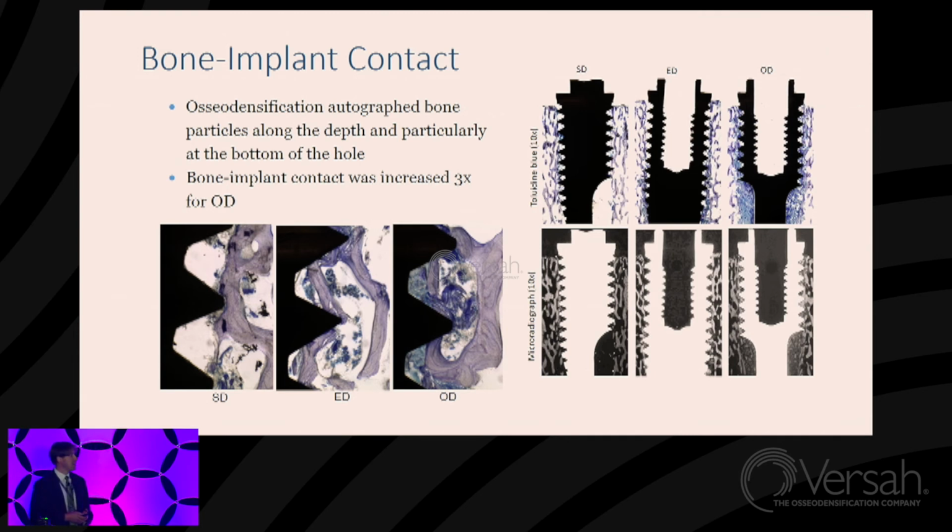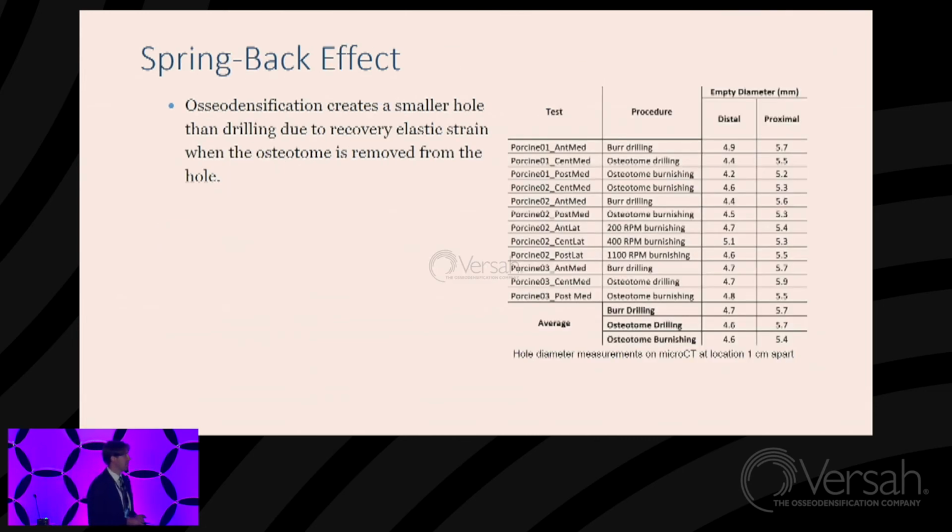Dr. Sleet has also done his own histological study, and other animal studies have looked at the bone implant contact response. This is just time 0, but now we're able to see similar results at time 0 as well as early healing responses in animal models.